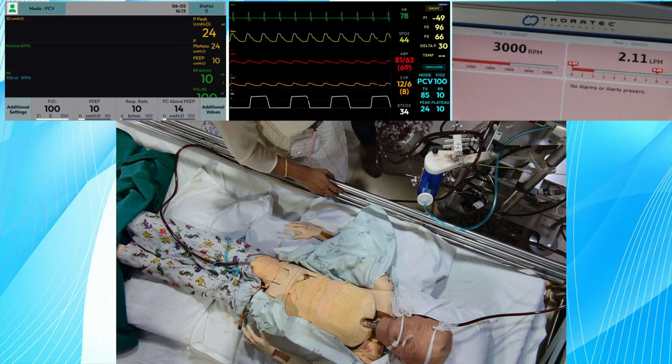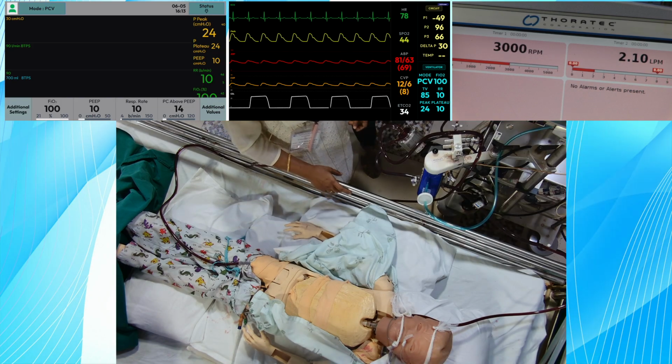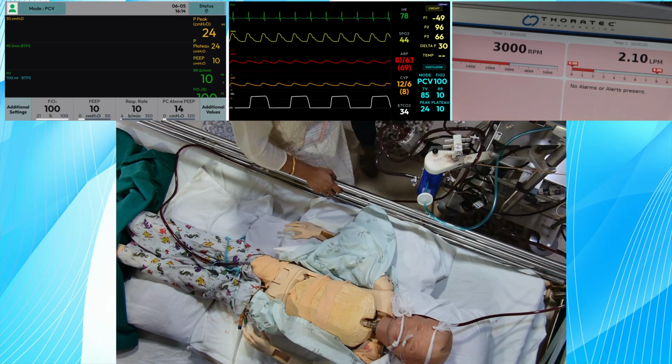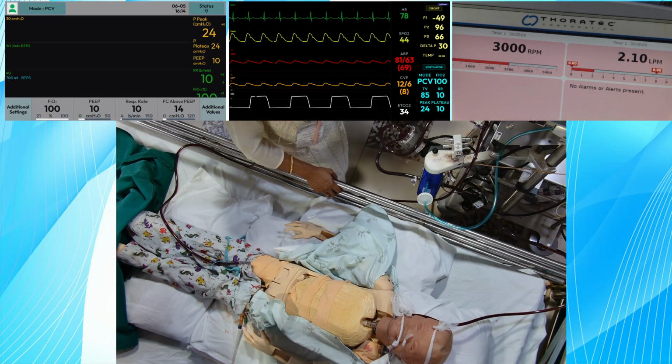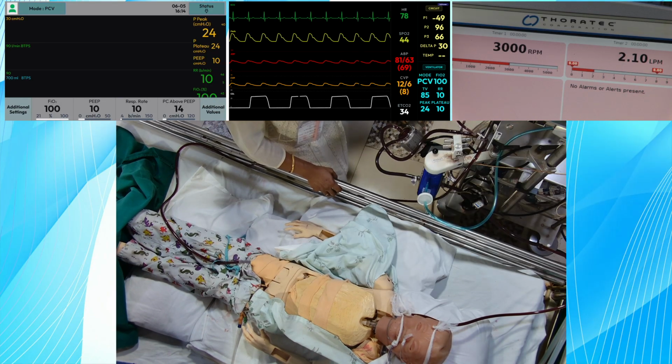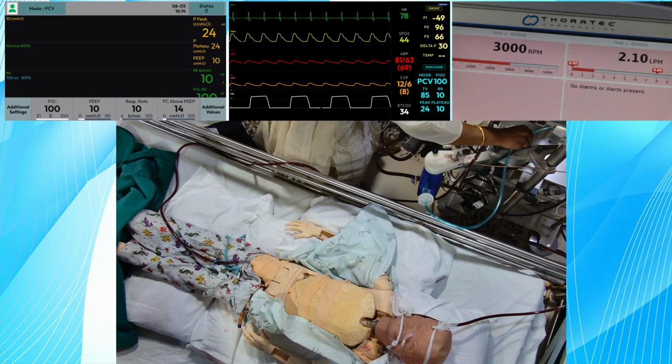One more oxygenator will be kept, or else you'll have another arrest. An oxygenator in parallel? Because the flows are less. Do whatever you want, but you have to justify to me what you are doing. A parallel oxygenator is going to cost 1,10,000, almost 5 to 6 times your course fees.